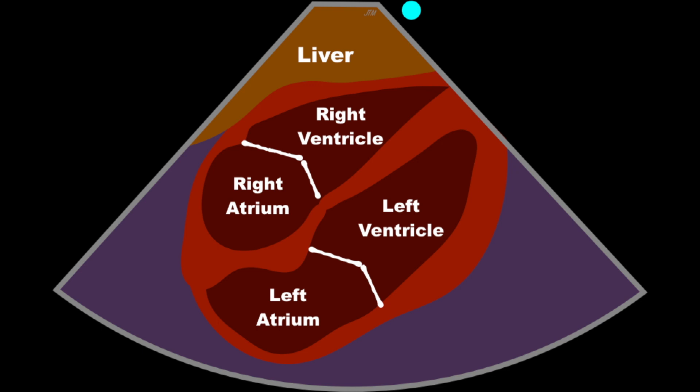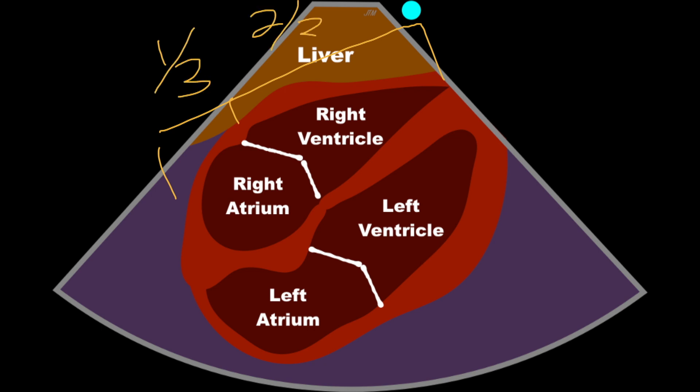We can also look at the entire length — this should be about a third of the whole length, and the ventricle should be two-thirds. If the atria is enlarged, it will take up more than that third of the whole that we should be giving it, and that would be a concern for enlargement, whether that be the right atrium or the left atrium when compared to the ventricles.